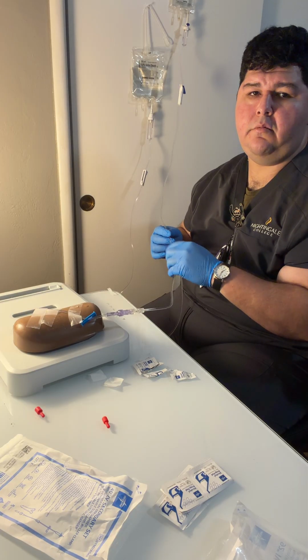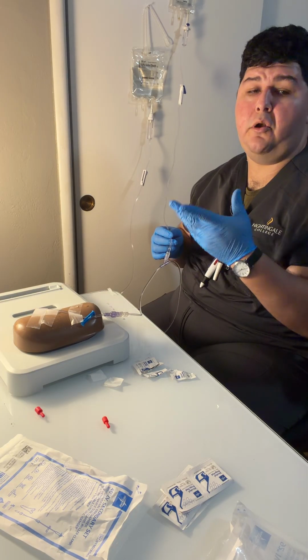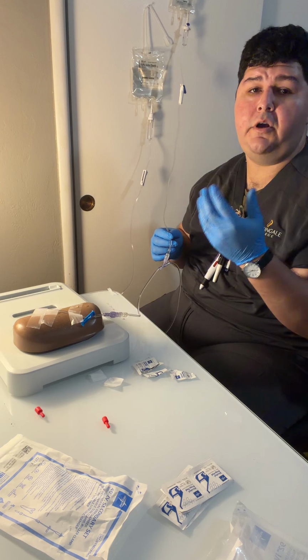And then we're going to open it slowly at a rate of 100 drops per minute.